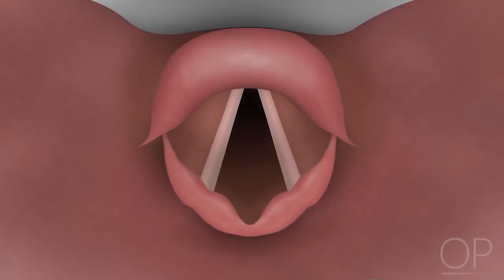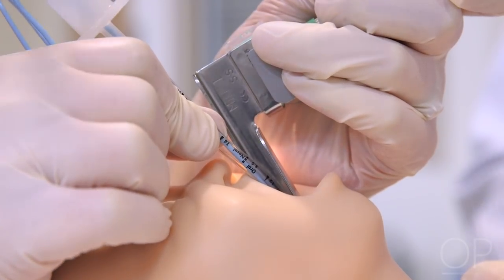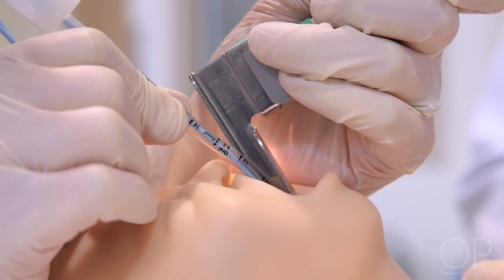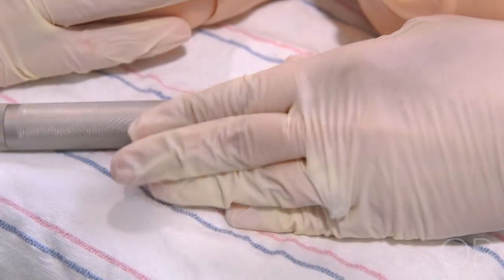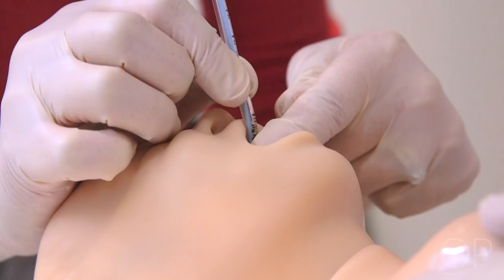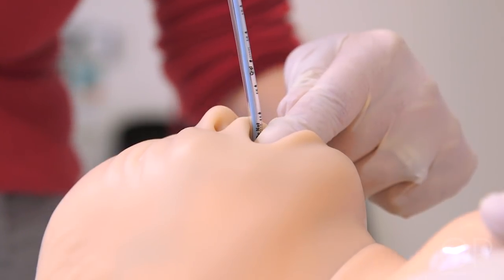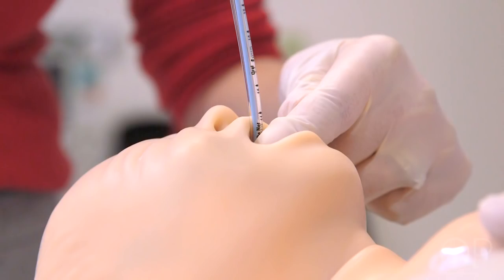These depth-guide lines may vary with different tube sizes and manufacturers, so providers should familiarize themselves with the equipment used in their institution. Once the tube has been passed through the cords, the provider should check the position of the endotracheal tube at the level of the upper lip. The laryngoscope blade is then removed from the mouth. The provider uses their index finger to secure the endotracheal tube against the roof of the mouth and releases their grip on the tube with the other hand. If used, the stylet is removed from the endotracheal tube at this point, and the depth of the endotracheal tube should be recorded.